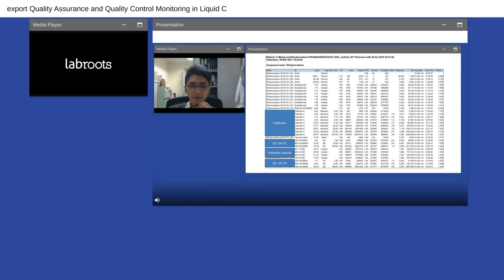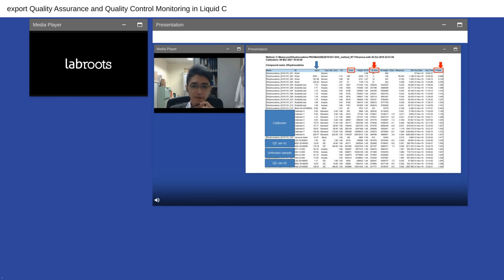Here is a typical data review for a quantitative assay — in this case, measuring dihydrocodeine. In the analysis, we have eight-level calibrators, two sets of QC, and some unknown samples. This table shows many LC-MS parameters, but usually what we look at is the ion ratio, the internal standard area, and the concentration of the samples. In the following slides, I'll share experience dealing with the internal standard and the ion ratio of detection.